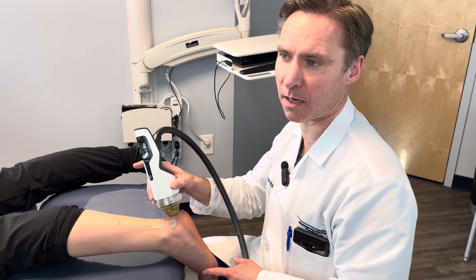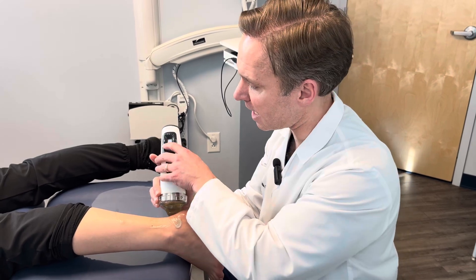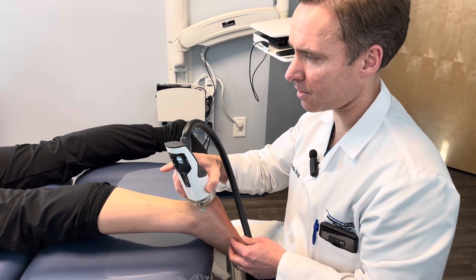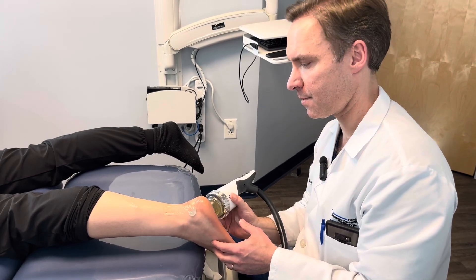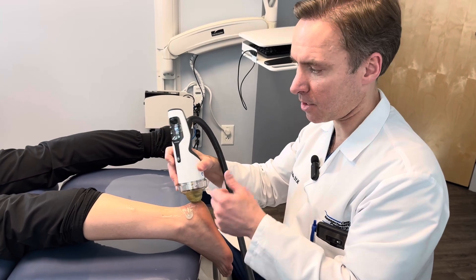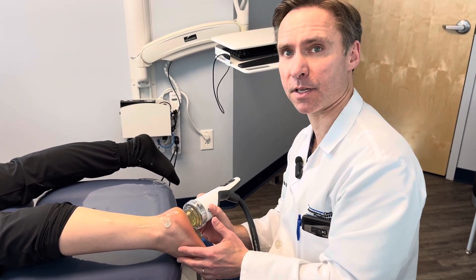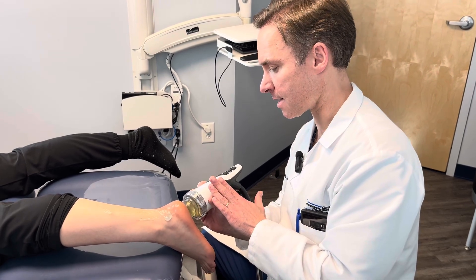If there's no pain, that's not an inflamed area. When working right on the bone like the back of the heel, you can't go up as high. When you're on the bottom of the heel where there's more padding and fat, you can increase it and they won't notice it as much. For the heel, you're going to hit right on the area of maximal pain — just sit it down there and stay on it.